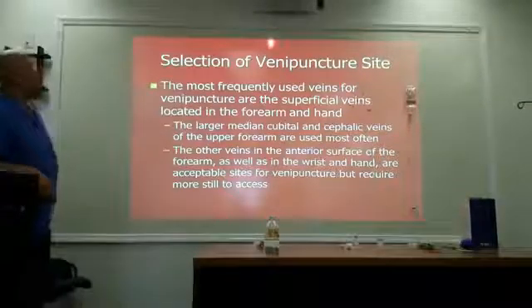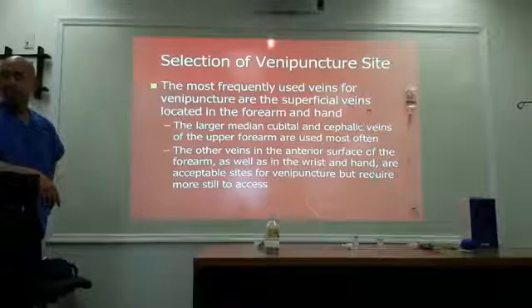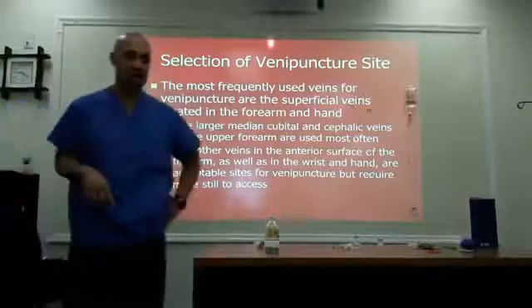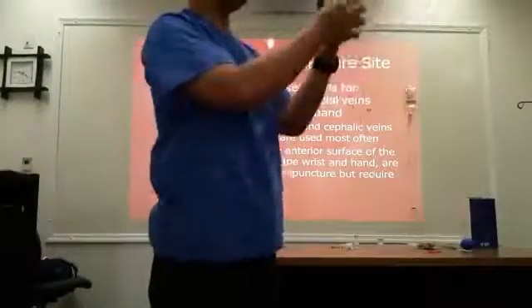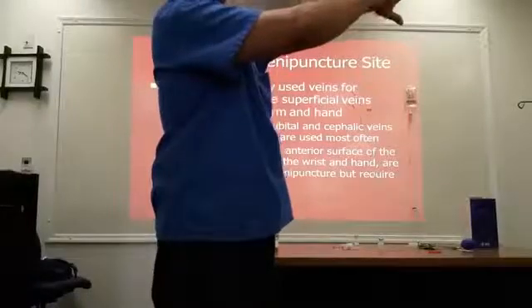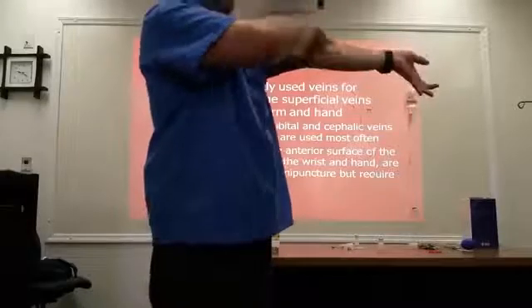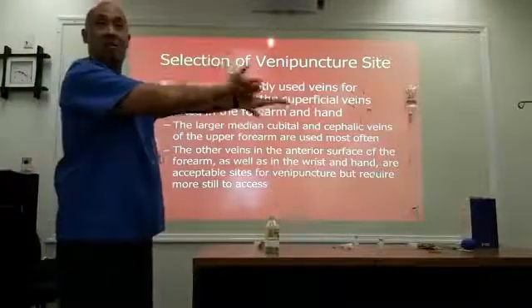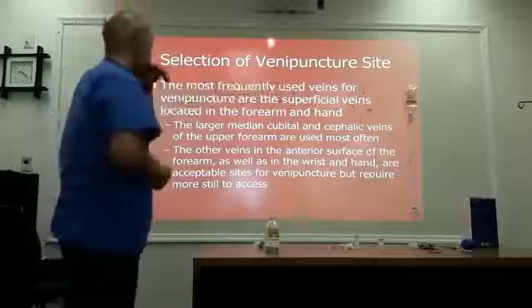Okay. Selection of venipuncture sites. The most frequently used veins for venipuncture are the superficial veins in the forearm and the hand. Forearm and the hand. We don't do fingers. I mean, we have some veins in there, but we don't do that. We got veins in our hands, our wrists, our forearm, our elbow, and then the upper arm. We go from here to here. That is our scope of practice. We can't stick anything else.